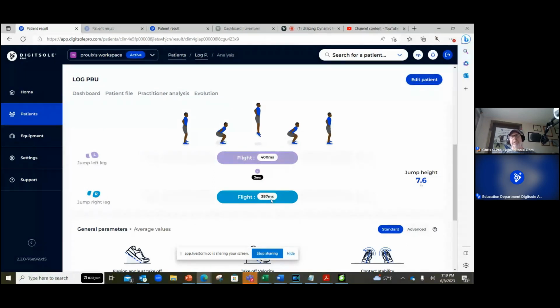Well, because we have a sensor in each foot, and then there's an aggregate, and the way that the algorithm works is very similar. We use a very similar algorithm that we use with force platforms. A lot of people ask questions like, well, how can you get jump height without actually measuring the height? Well, we're measuring displacement, and we know the effects due to gravity, and it's, as we say, just simple physics. Which for some people it's not simple at all. But that is a very well-known and validated algorithm that we can actually measure center of mass displacement with the sensors with the timing effect.